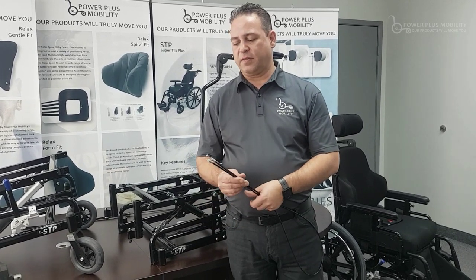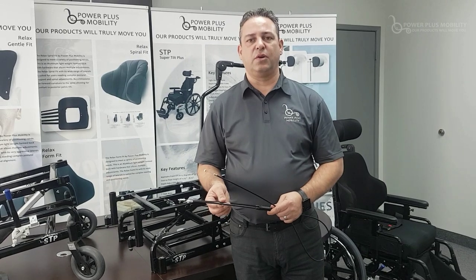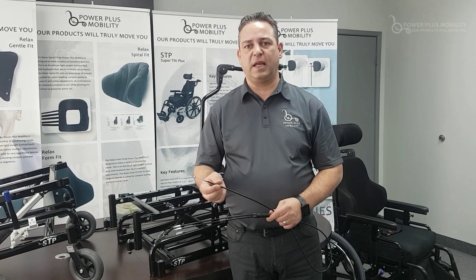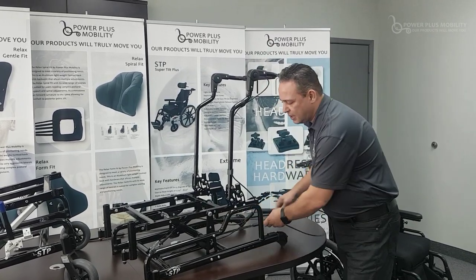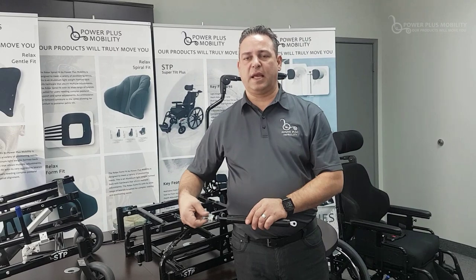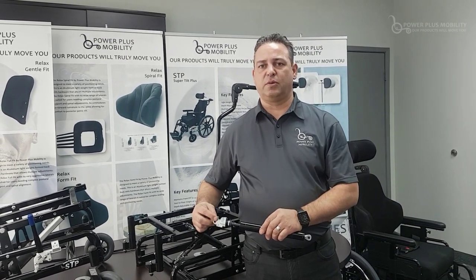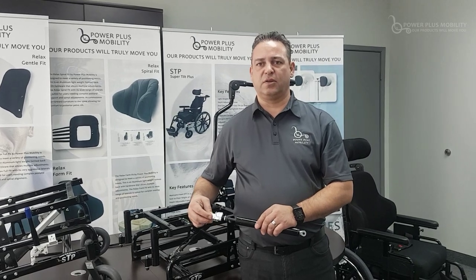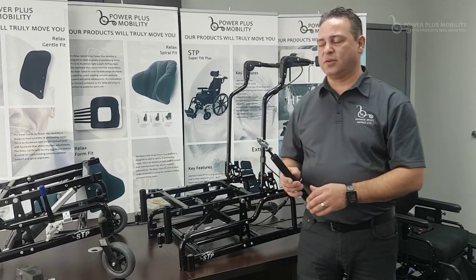If you look at the cables shown here, you'll notice there is no brake adjustment within the cable itself — the adjustment is done through the cable head. Through the cable head we're able to adjust the tension of the cylinder, which makes it very easy to install and adjust the tension of the actual cylinder.